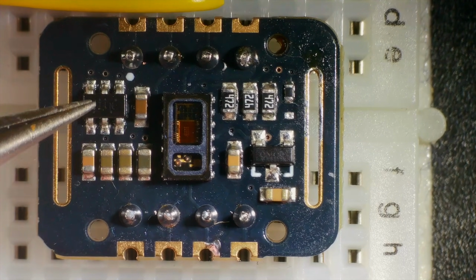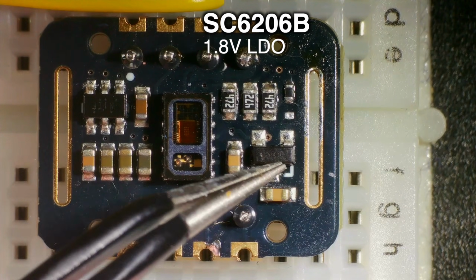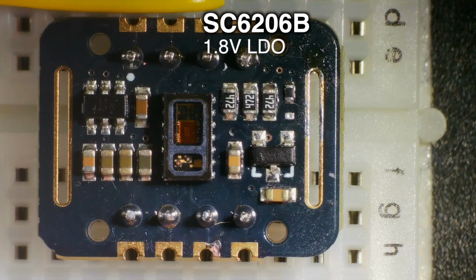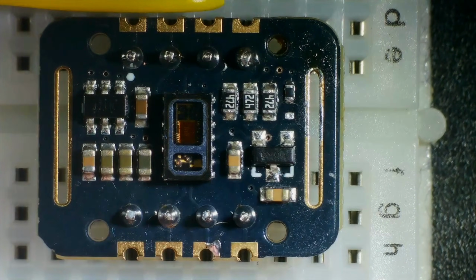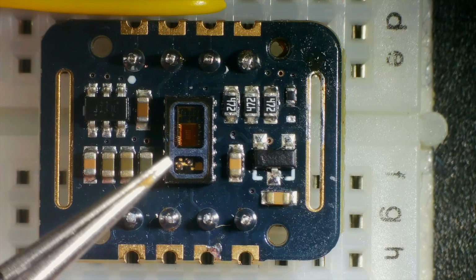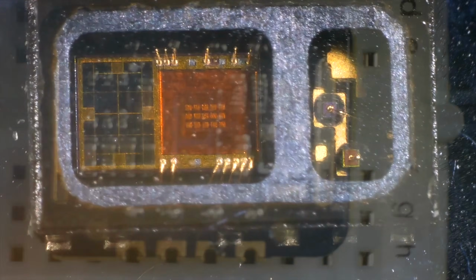Do the old solder check. And then there's also a 1.8 volt regulator here. Now I have read a few things where some people have found that actually this is a 2.8 volt regulator rather than 1.8. Pretty important that it is correct. Now I've checked the voltages on this and it is fine. But the really interesting thing on this board is the actual sensor. So let's zoom down on this and have a close inspection of it.